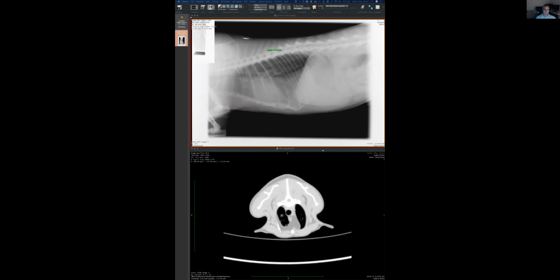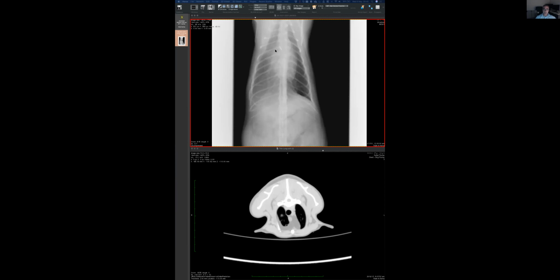So the location is in the pleural space, everything fits, and the consistency, the attenuation of that tissue is not fluid, but fat, which is more opaque compared to gas. Therefore, it looks like an increased opacity, which makes complete sense, like here, but it's not behaving like fluid in terms that it's not silhouetting. Make sense? So now we just untangle the whole thing, and now by saying that there is a lot of fat in that pleural space, then we can explain.